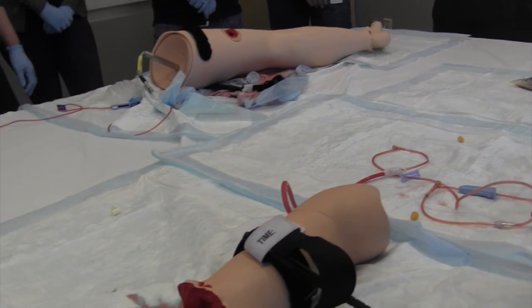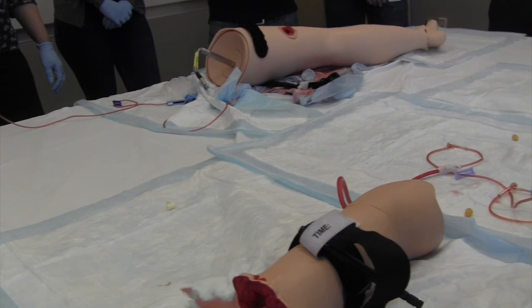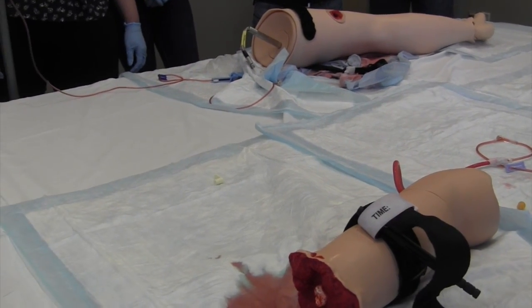We've been teaching four to six hours. It's really important to put the time on there so the providers know when it went on. Also, these are really painful when they go on, so that's another way to know if you're doing it correctly — it's going to hurt.